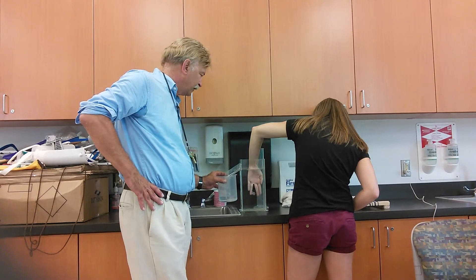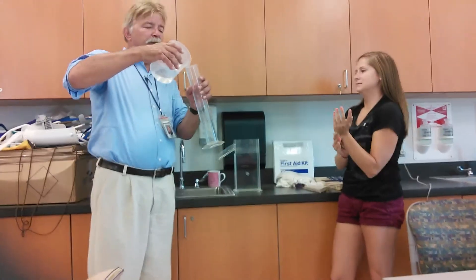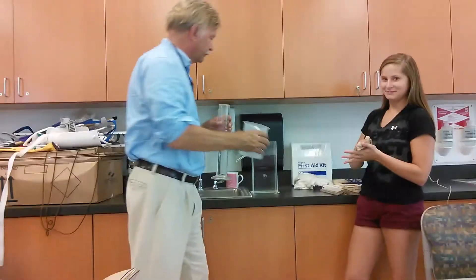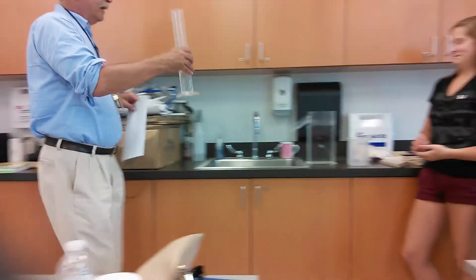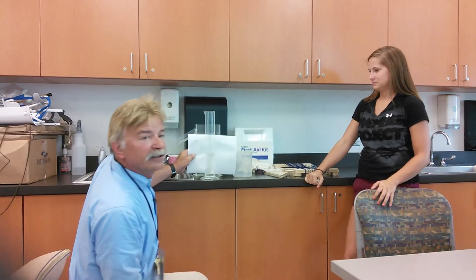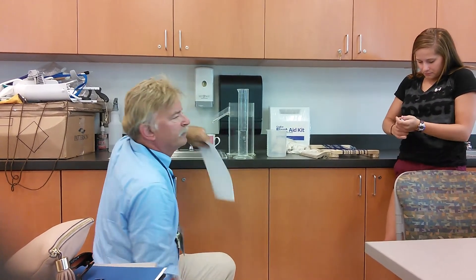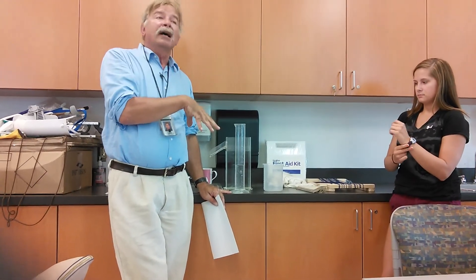You're going to take the water from the beaker and you're going to put it into this device which is called a graduated cylinder. Put the graduated cylinder down and I suggest holding a piece of paper behind it so it's easier to read. In this case, she has 250 milliliters of water displaced. Then you're going to document that.